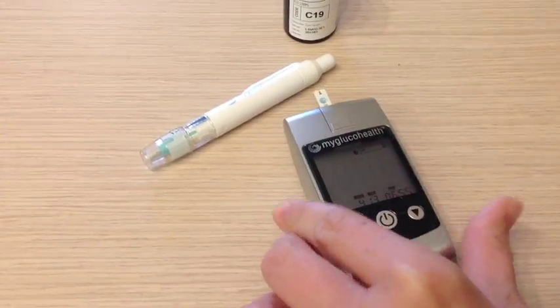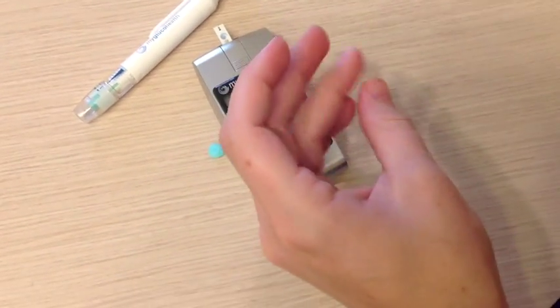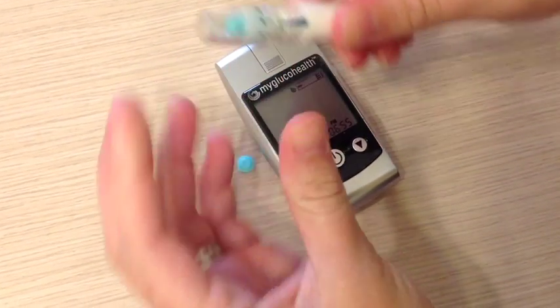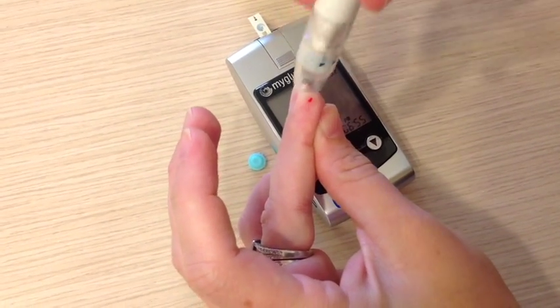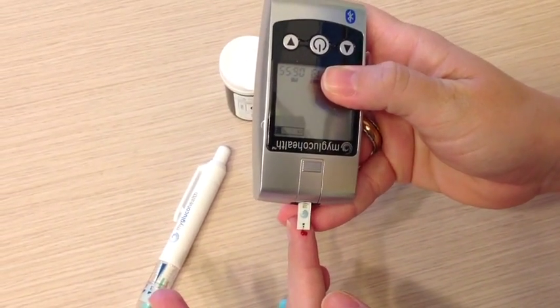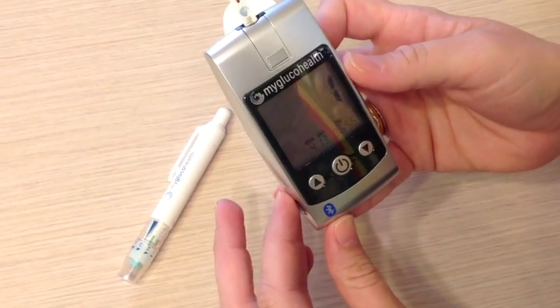You can see that the device is lit up and it's wanting us to put some blood on. So what we'll do is clean off our finger. I'm going to turn this to a 3 and use the lancet device.